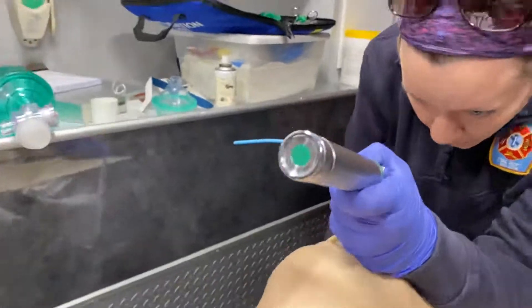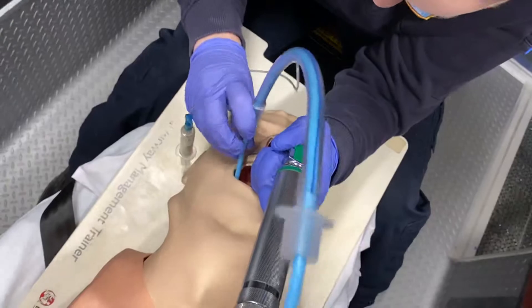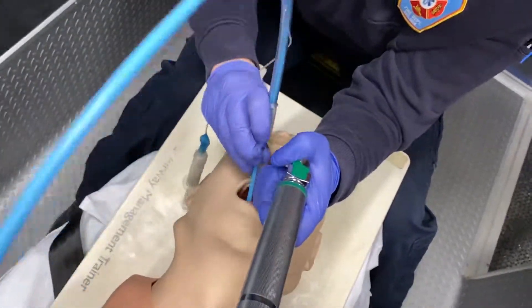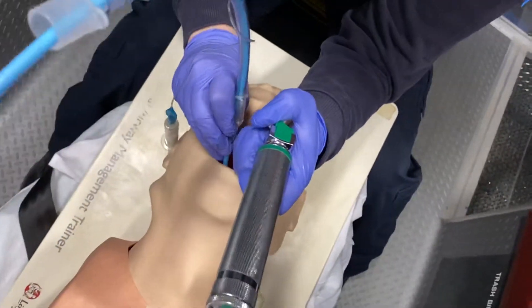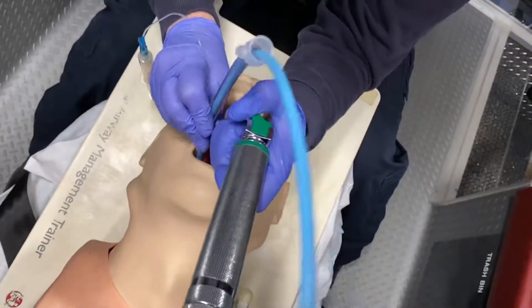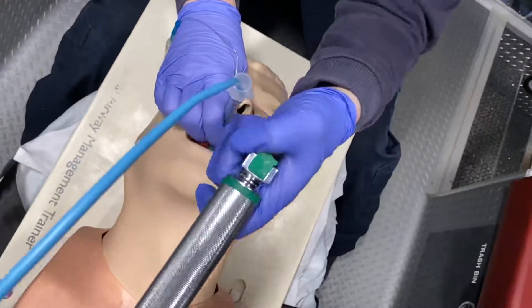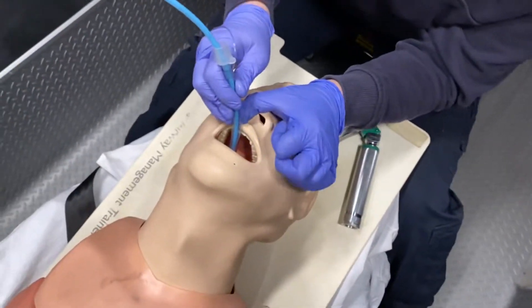I'm going to visualize the airway and take the end of my gum bougie and insert it in. The bougie has a hook at the end — we can slide this back and forth and feel the tracheal rings of the patient to confirm we're in the trachea. Then I'm just going to slide my ET tube down over it and watch the balloon go in through the airway.